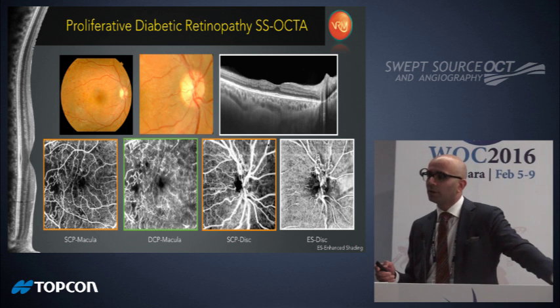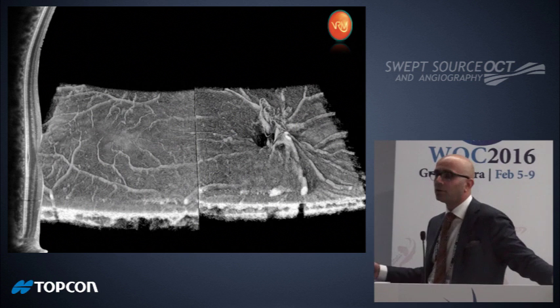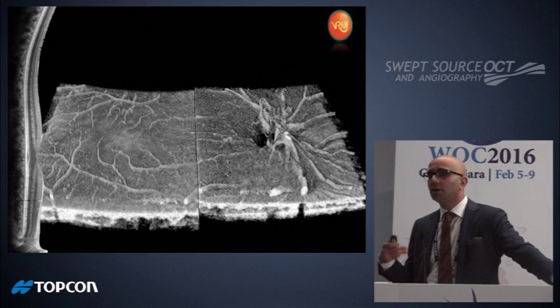And again, when we look at the relationships, this is a montage rendered video. What we can see here is that neovascularization of the disc beautifully in this video before it fully presents itself. It's really a novel way of looking at diabetes that we have not been able to look at before, and Vas showed earlier the microaneurysms that were seen in the deep capillary plexus. How this will continue to evolve our understanding of these diseases remains to be seen, but the fact that we're looking is a step in the right direction.